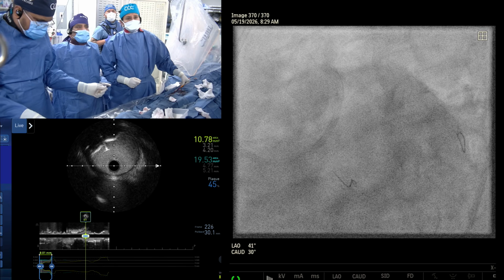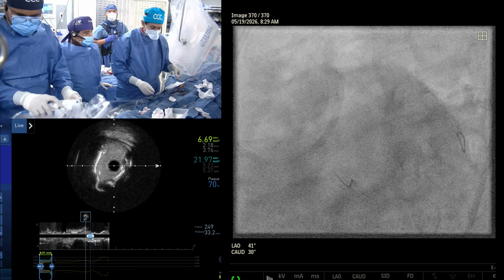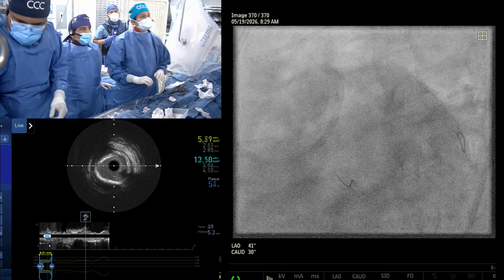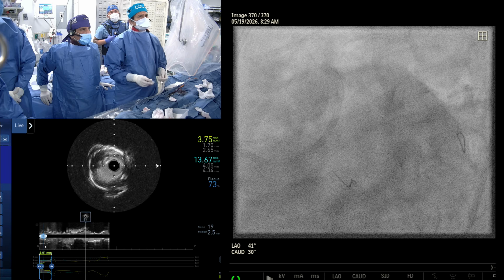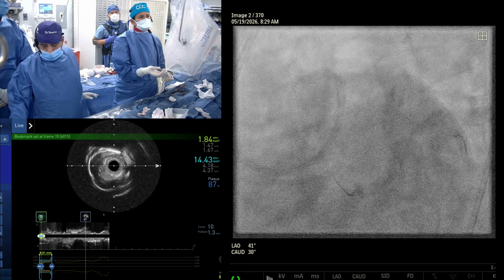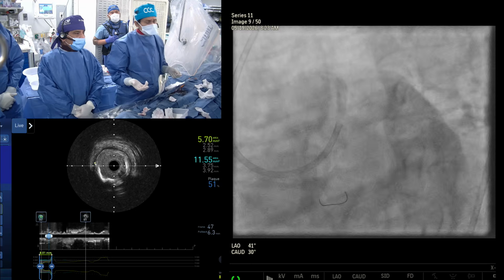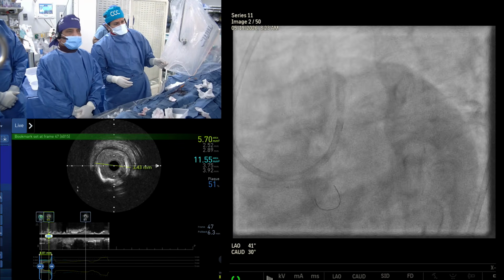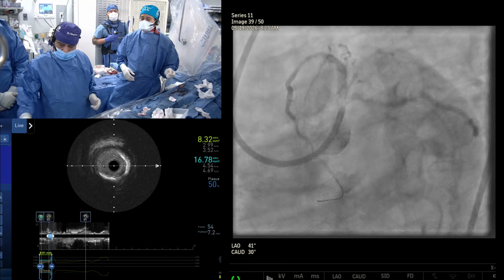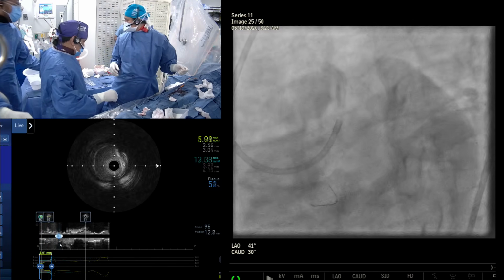Okay, let's put a stent there. I mean, cut and then put a stent. A cutting balloon? Cut where? The circ. The same one the IVL will do for the LAD, left main. Let's put a stent in the circ first. Why do you want a cutting balloon? I have a regular balloon. There's nothing there, additional cost. There's a little bit of calcium, but proximal, nothing more. So you have the imaging there. It really is amazing. There's so much calcification in the 3 to 12 o'clock ostium and proximal LAD, and none in the circumflex. High-pressure balloon. Yep, that's correct.